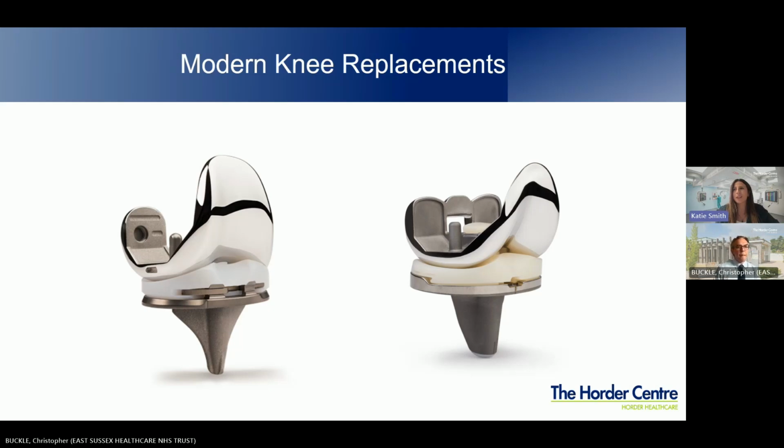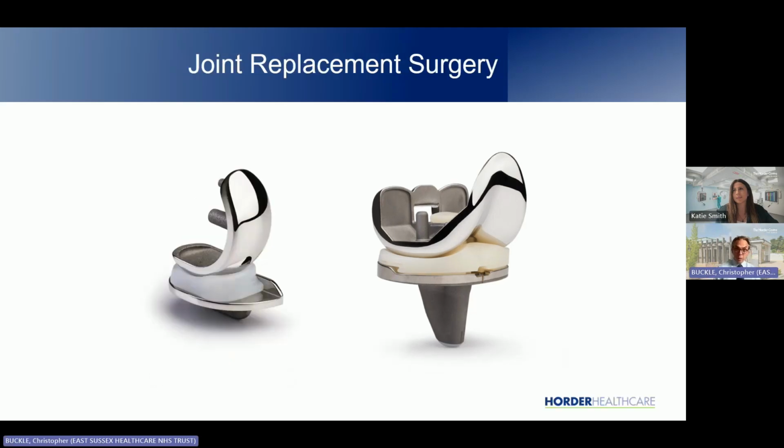Another one we have here, how effective are partial or unicompartmental replacements, such as the conformis type for the lateral compartment? So partial joint replacements, again, I perform lots of partial knee replacements, and there are those advantages that we did talk about. Specifically functional outcomes around partial knee replacements, lower risks of surgery. But the most important thing is the counselling around risks of redo surgery later on. Now, in my opinion, those risks are suitably low enough that it is reasonable to go ahead with partial joint replacements in the right patients.